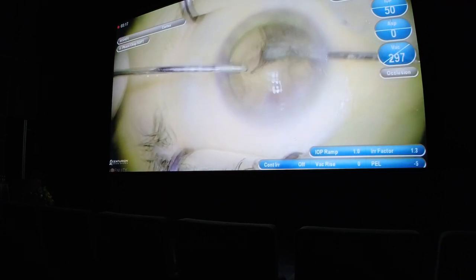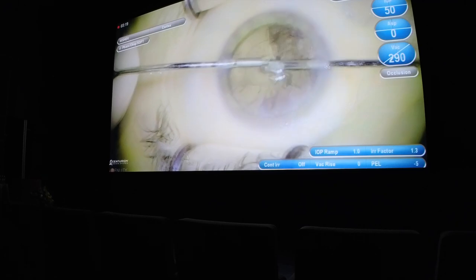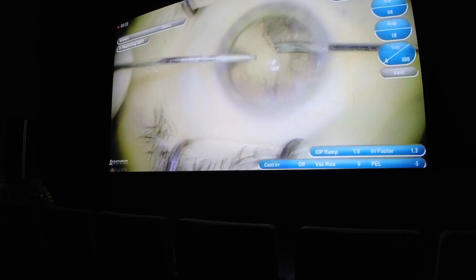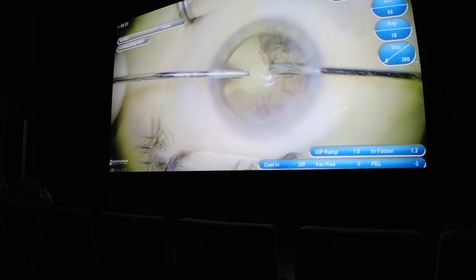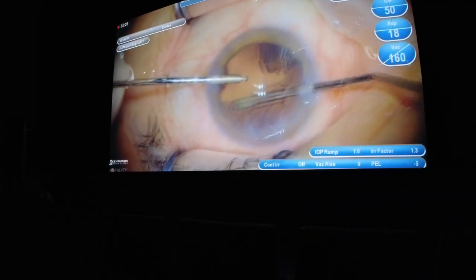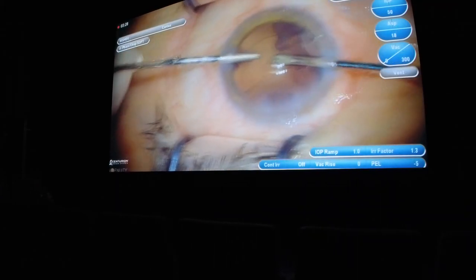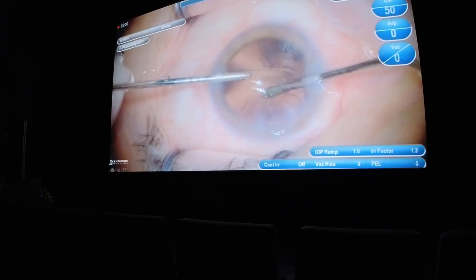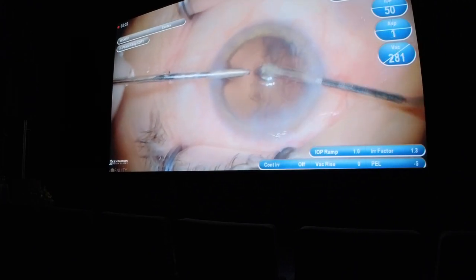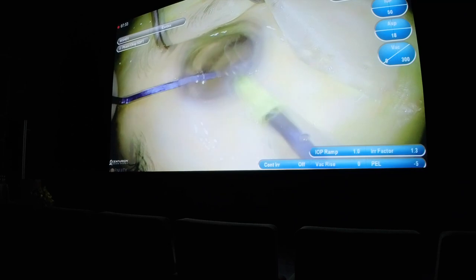Here in irrigation-aspiration, this is another type of digital filter which is custom-made. The aim is to increase the contrast of the capsule and the cortex so it will be better to distinguish them.